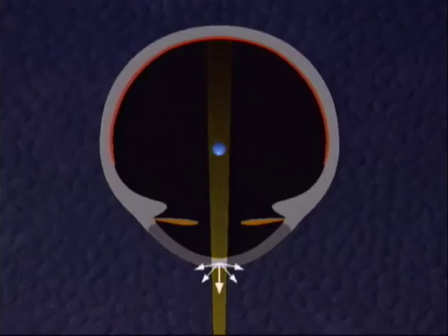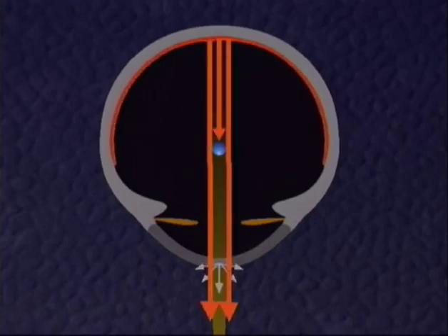For example, the phenomena of direct light at the cornea, that is, scatter and reflection, hide the structures behind the illuminated corneal tissue because they make this tissue non-transparent. On the other hand, indirect light decreases the visibility of scattered light and reflexes at the cornea and improves the visibility of objects behind it.